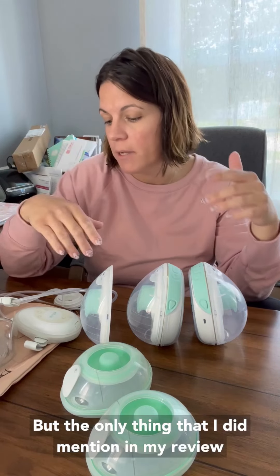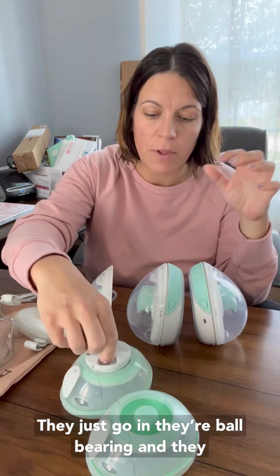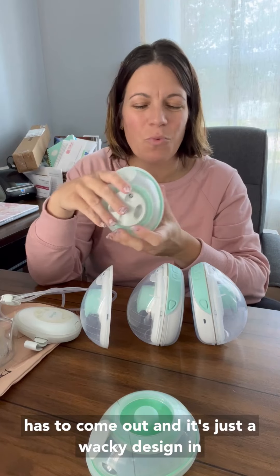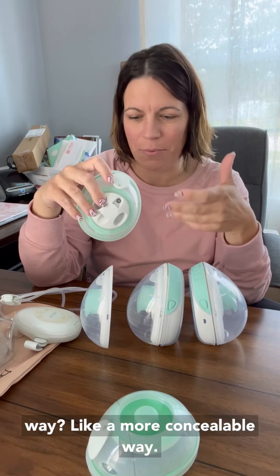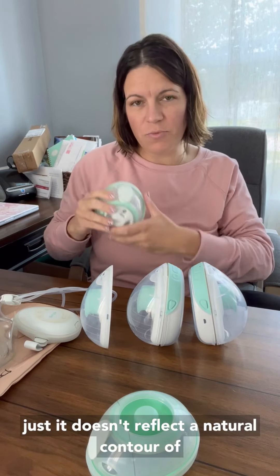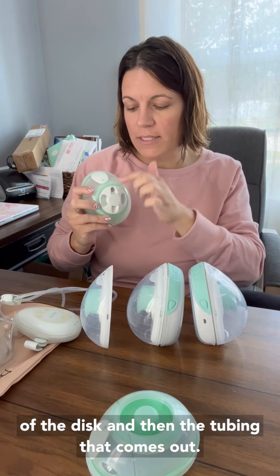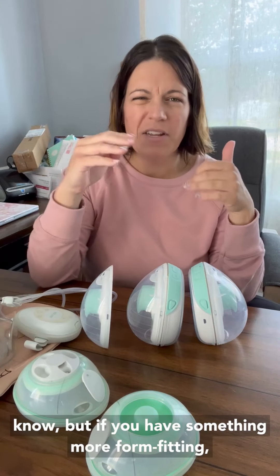The only thing I mentioned in my review is you've got these goofy discs. These discs just go in like ball bearings and clip right into the front, but then the tubing has to come out — it's a wacky design, like over-the-top fancy. Why do we have to do all this? Isn't there a more concealable way? So the tubing comes out and you've got this weird veiny thing going on on your boob. It doesn't reflect the natural contour. With a sweater you'd never know, but if you have something more form-fitting, it's kind of funky.